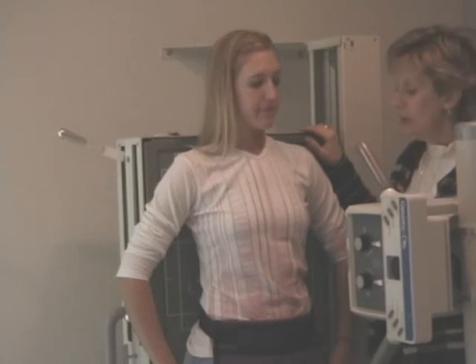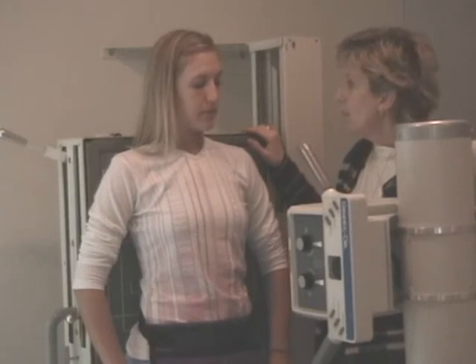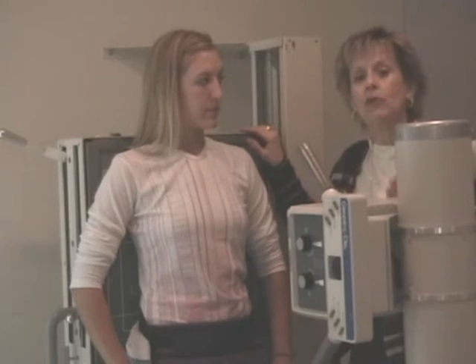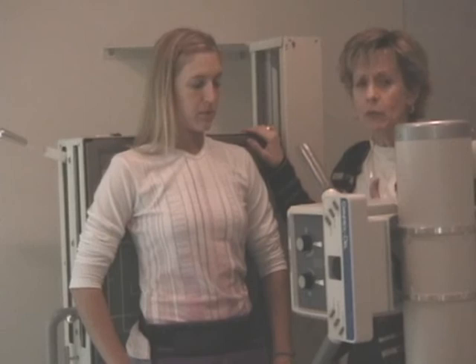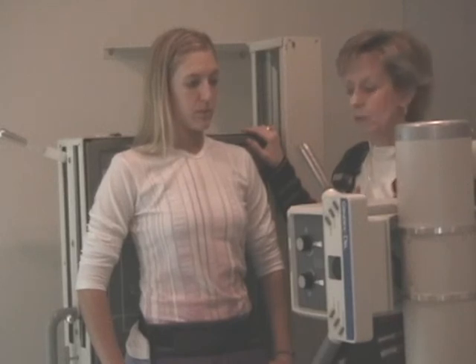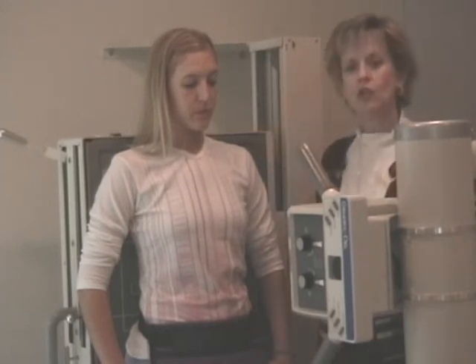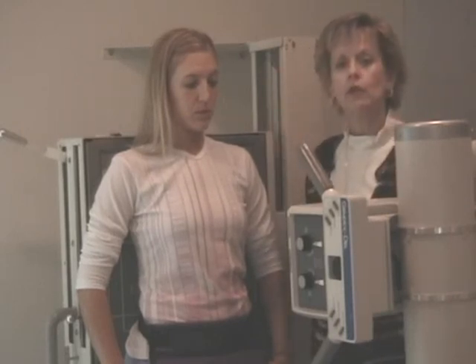Now, some other scenarios that you might get into is bilateral ribs. In Kristen's case, she fit both ways, so I would just do one AP. I would have both ribs. I would do both obliques, and I would do both below diaphragms. If it was bilateral, somebody who's larger, you could take a 14 by 17 and go crosswise with your films. The below diaphragm, Kristen's habitus, she's longer and not so wide. I'd leave the film lengthwise.